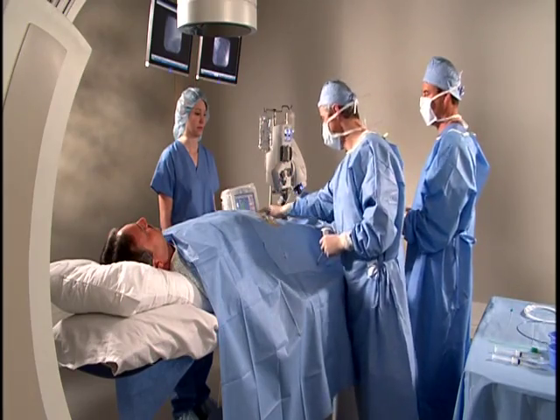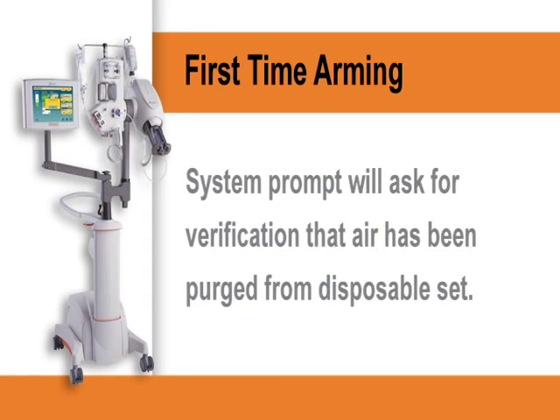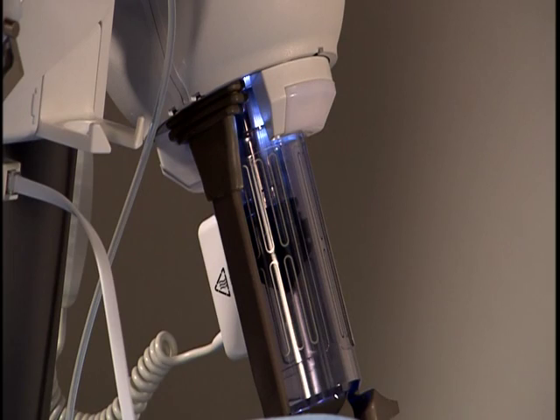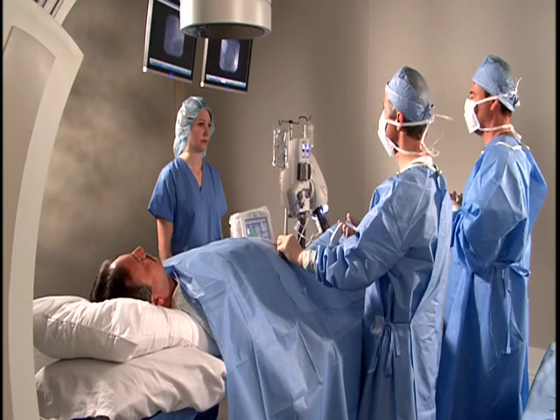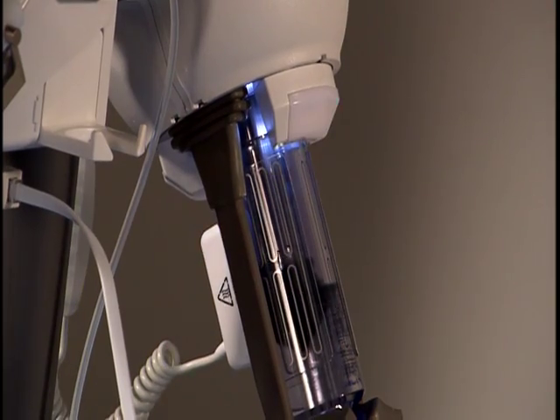To perform a test injection, touch Test to arm the system. When arming for the first time, a system prompt asks for verification that air has been purged from the disposable set. Touch OK to confirm. The Check for Air icon will highlight with a yellow background, indicating the system is ready to inject. The armed indicator light on the injector head illuminates when the injector is armed and flashes during an injection.